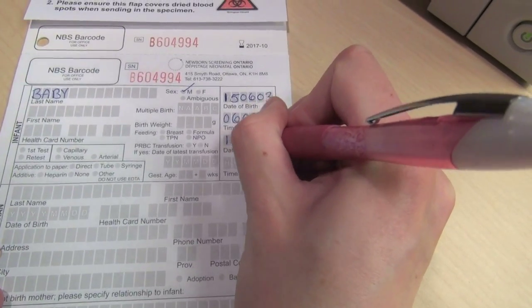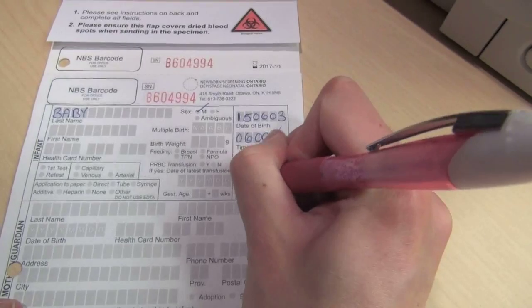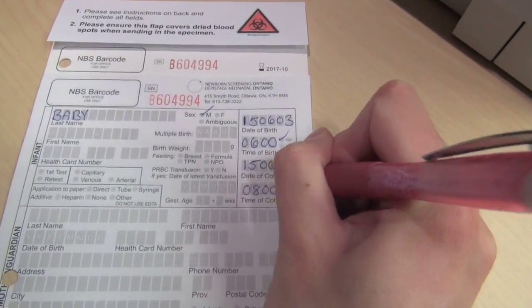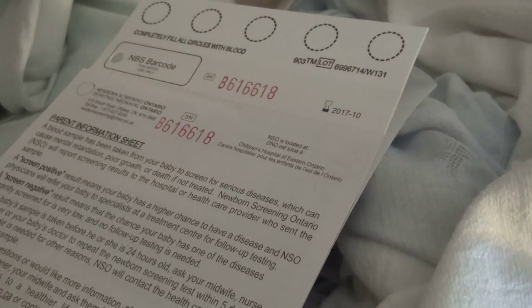Ensure that the newborn screening Ontario requisition collection card has not expired. Complete the demographic section of the attached specimen collection requisition, ensuring the accuracy of the data on the card.